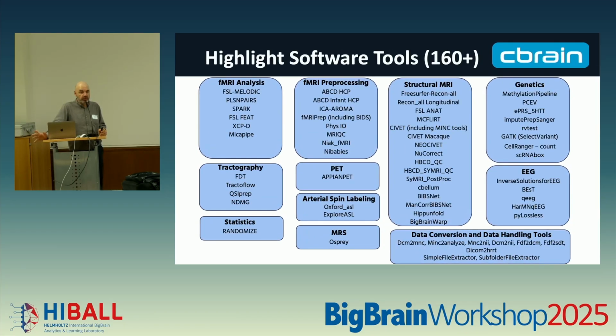And if you want to get into more detail, I won't enumerate all these. There's too many on the screen and too many more on the list. But you can see it covers the full spectrum, from things that are more structural in nature, structural MRI analysis, all the way through PET analysis, tractography, all the way through. And then, as Alan was saying, we're adding more and more tools, particularly on the genomic side, single-cell transcriptomics. But really, with it being container-based, as I said, CBRAIN is really agnostic to the science.